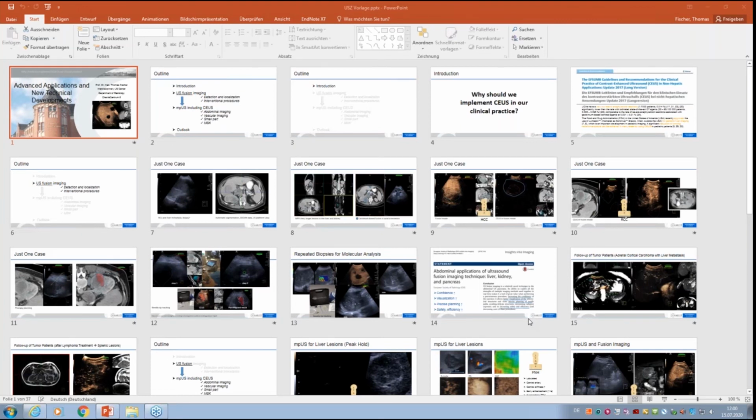I have one question from the audience. Do you know if there's software for volumetry, for example, in liver or liver lesions? Yeah, at the moment this is a trouble because we don't have this nice software to get also volumetric results. It doesn't exist in our daily routine, but we work very hard with different companies on this topic, and hopefully next year we can present these results, because I think that's very, very important to get a tumor load on a patient, to select the whole volume of metastasis in the liver, to be sure and more comparable with the CT scanning. Yeah, absolutely.